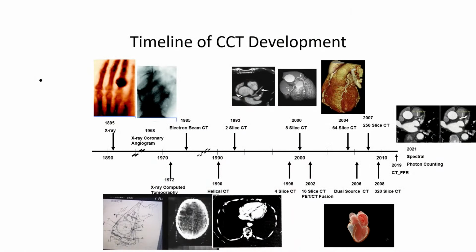So this is a timeline for those who are not familiar with the development of cardiac CT.